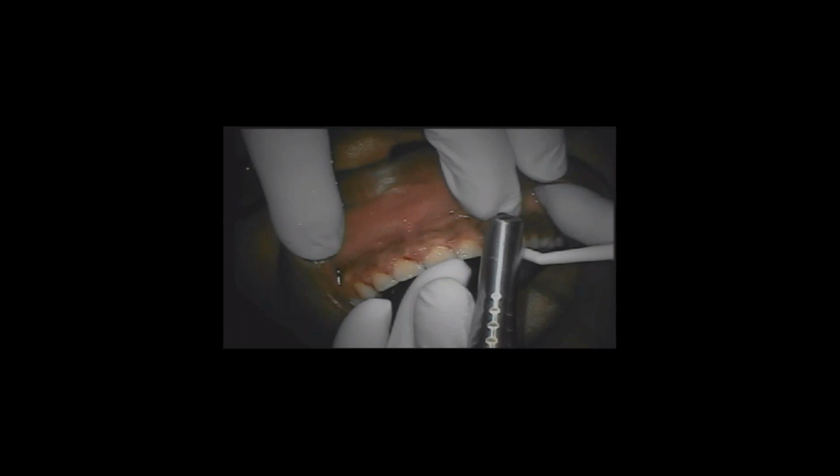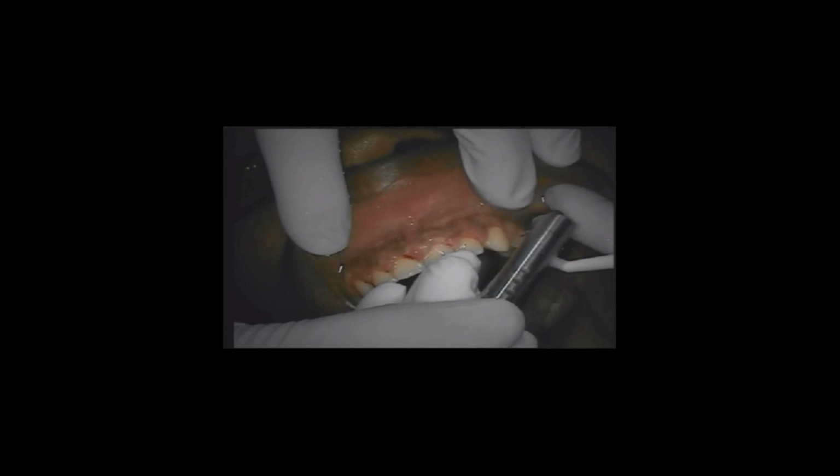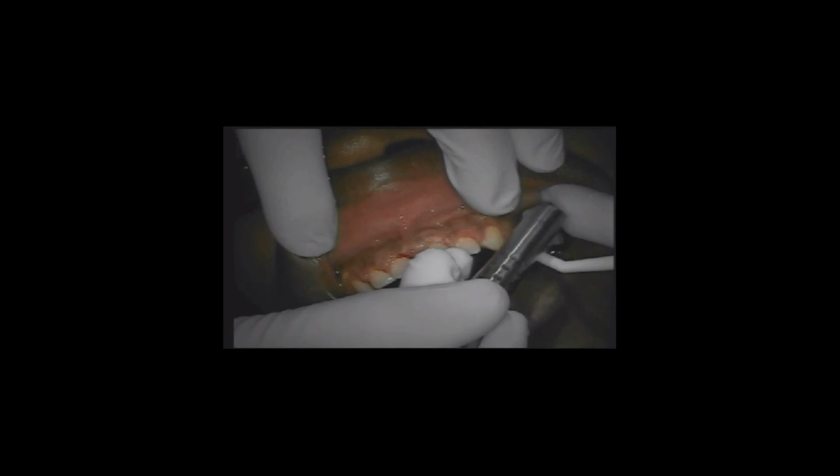So we'll do some on the top. On this case, he had a lot of tissue buildup on the bottom. This patient started off with about a 3 to 4 millimeter diastema between 8 and 9, and just a lot of generalized spacing in other areas. And as we brought those teeth together, you can see the bulky tissue that gathered, and even a frenum between 8 and 9. We'll finish this case with a frenectomy as well.